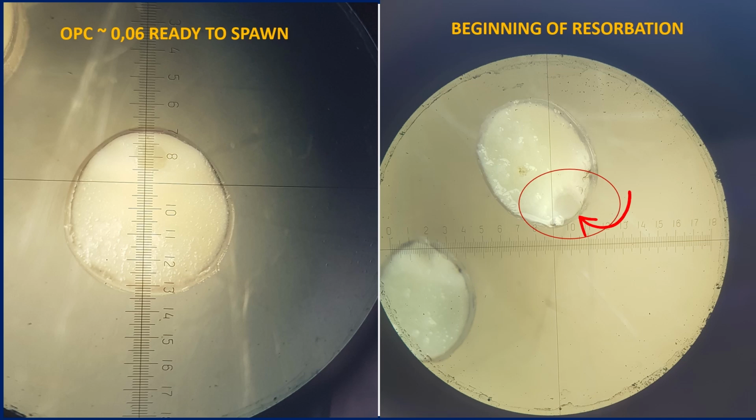This is an over-matured female that has been kept at spawning temperatures unnecessarily long. There is still a small chance to get eggs from such a female after the hormonal injection, but the eggs will only be suitable for food purposes and it will not be possible to fertilize her.